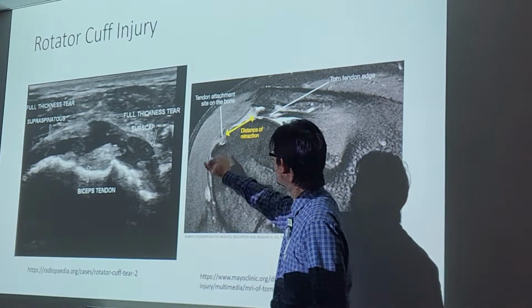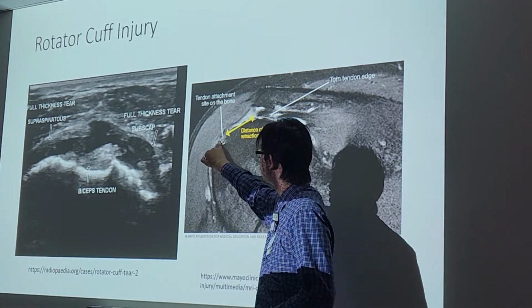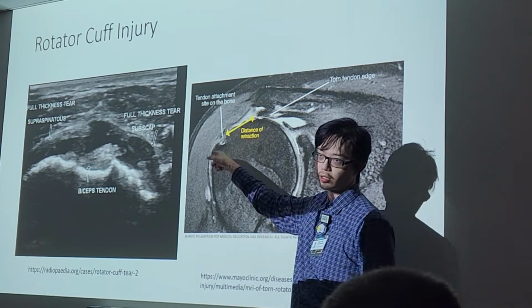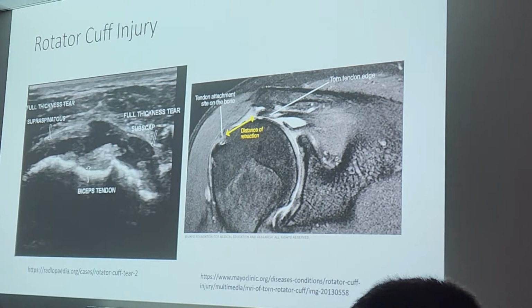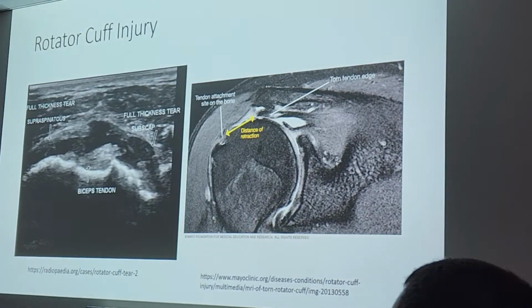If you look here, the tendon should be here, tendon should be here, tendon should pass through here as well. But instead you've got this white area. That white area is fluid, so that means you've just got the joint capsule there instead. So in this case, there has been a torn tendon. The tendon ripped, and that is our rotator cuff injury there.